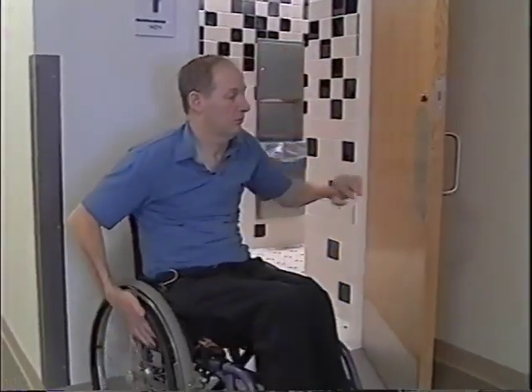Okay? So there are a number of ways to do that. And sometimes the trickiest part is just getting your hand into the door. So keep that in mind. Also keep in mind you need to get your hand out of here before you push the door open. So you don't want to open the door too much before you get the door jammed on your hand.